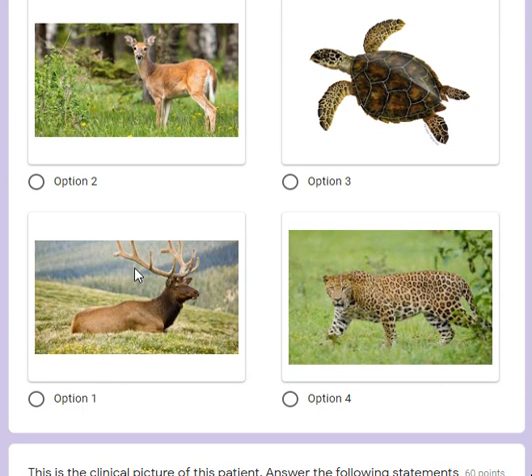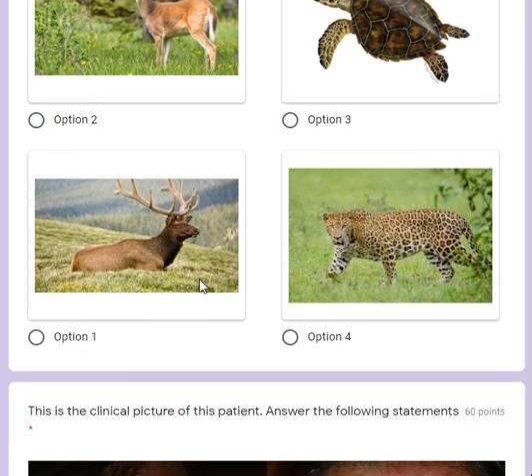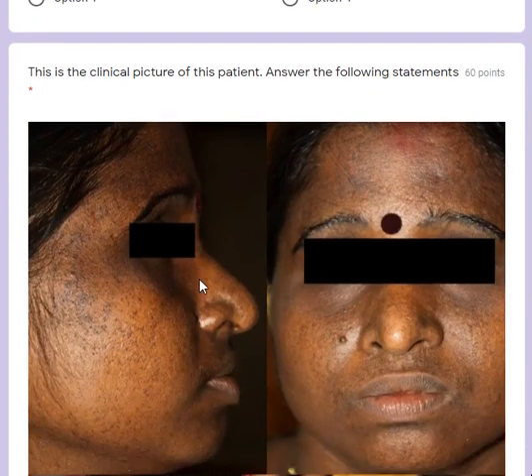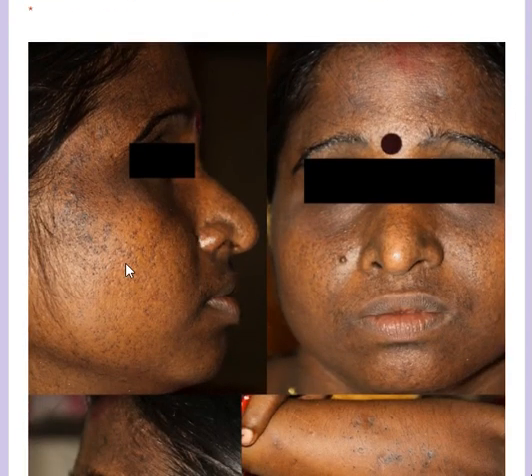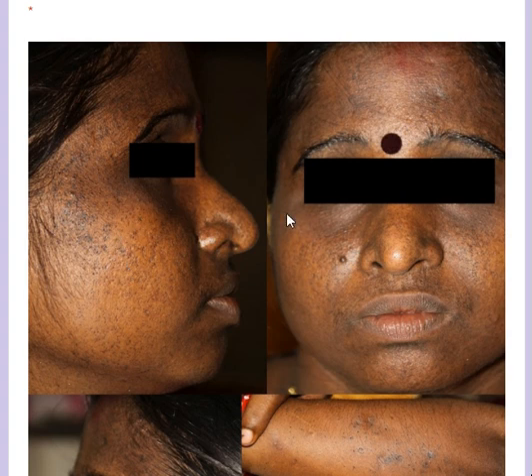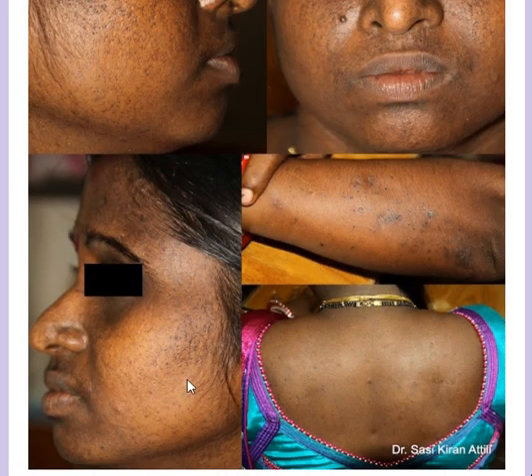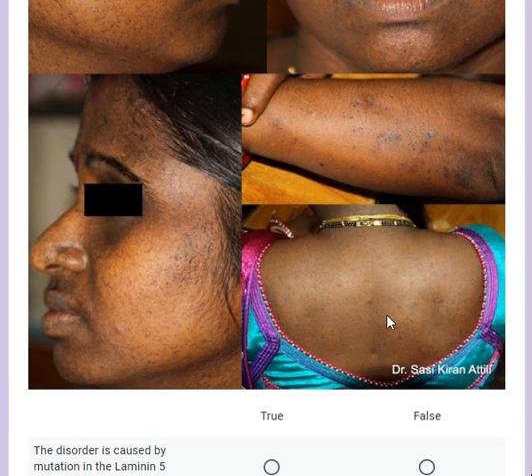This sebaceous gland is opening directly into this structure with the hair being absent. What animal does the histology remind you of? These are antler-like rete ridges - the horns are branching, and that's what the rete ridges are described as: antler-like elongations. This is the clinical picture of the patients, showing multiple pitted hyperpigmented lesions on the face, forearms, and upper back.